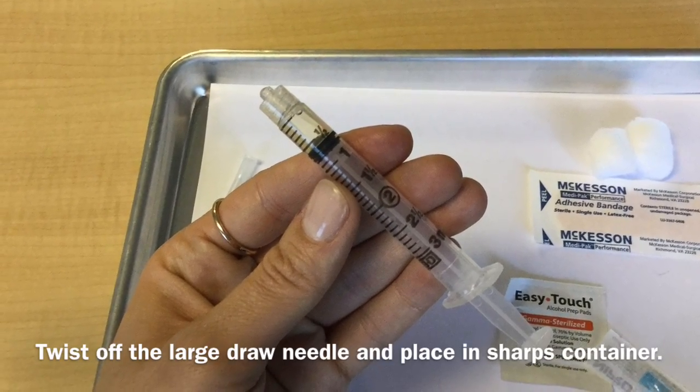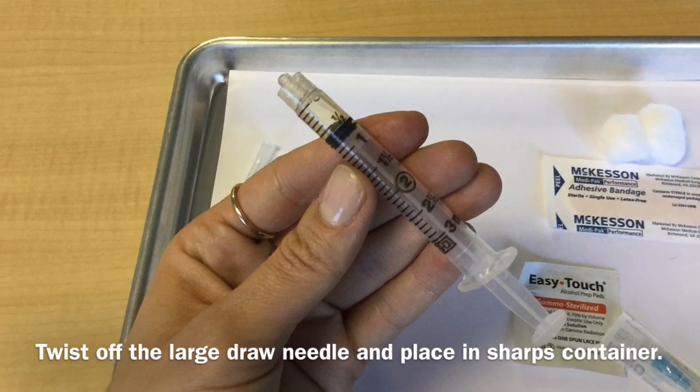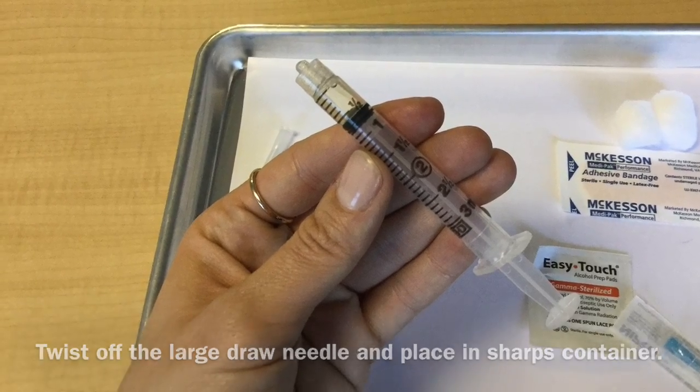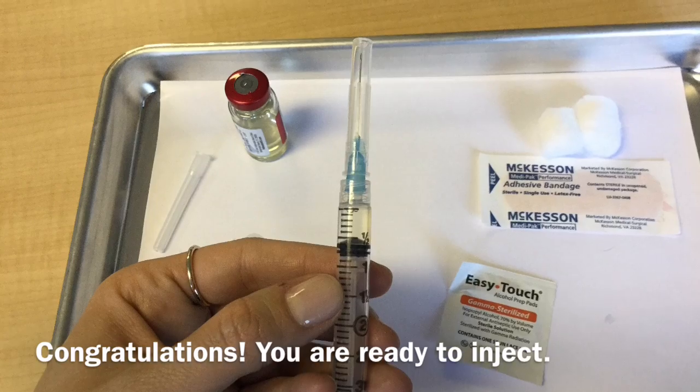Next, twist off the needle you used to draw up the testosterone, place it in the sharps, and go ahead and open your 25-gauge needle and twist that onto your syringe. Now you are all ready to inject your testosterone.